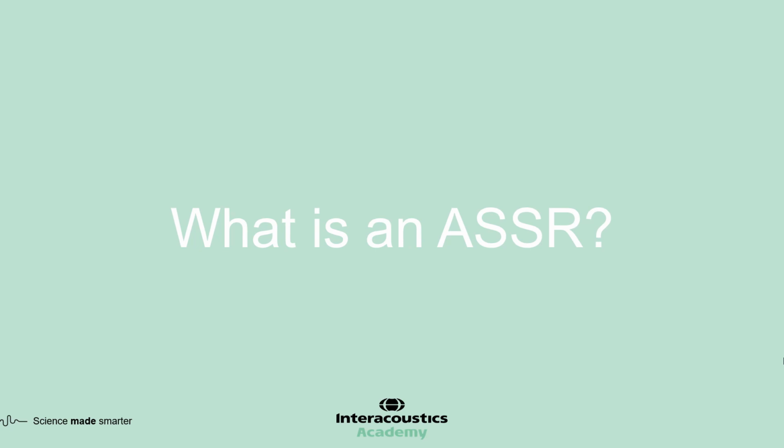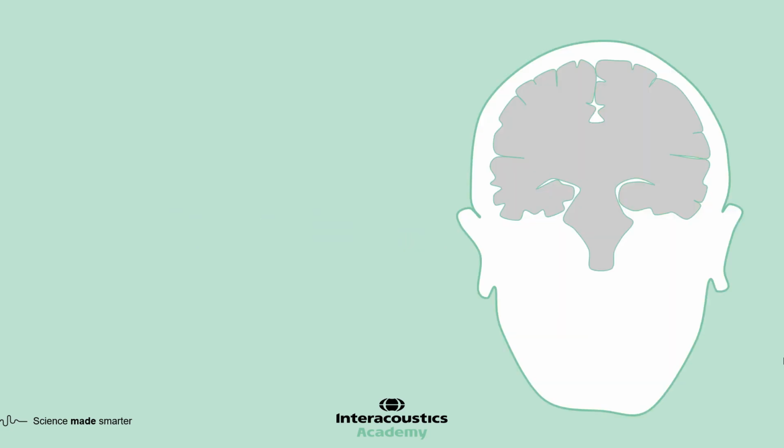This short video explains the concept of the auditory steady state response. Like ABR, ASSR is an evoked potential which is generated in the brain in response to sound. To record brain activity, we need to apply electrodes to the head of the patient.